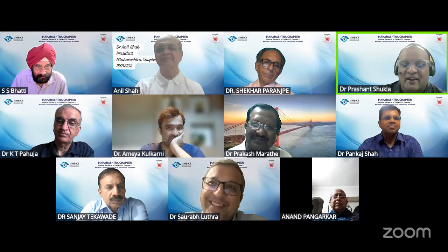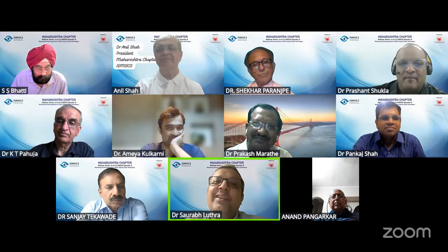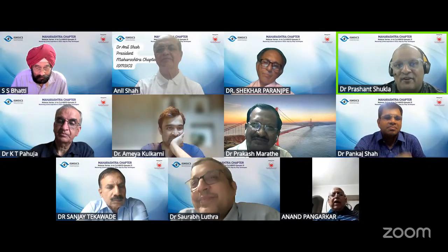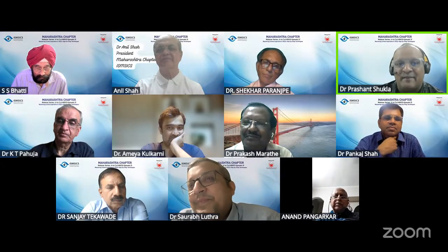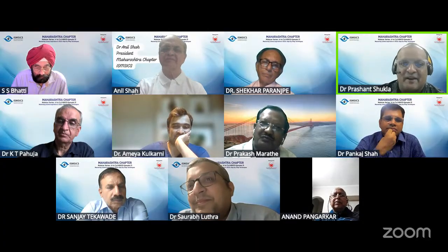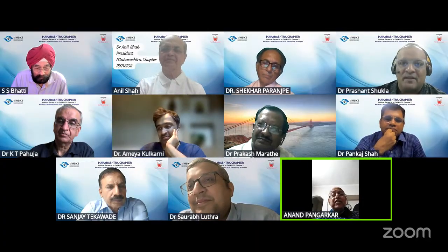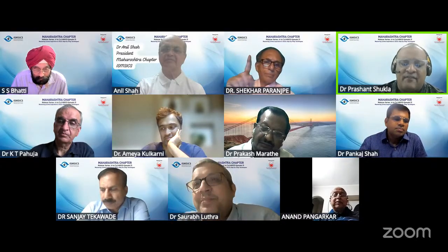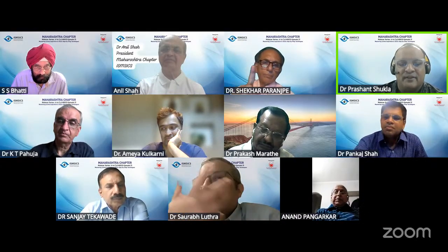Those patients are doing very good, although they have a certain amount of astigmatism, but there's hardly any PCO. They've got those PMMA lenses from Pharmacia that my dad used to implant 25 years back. And there is no PCO. I have operated cases 2 years back with good hydrophobic Indian lenses, and they have PCO.